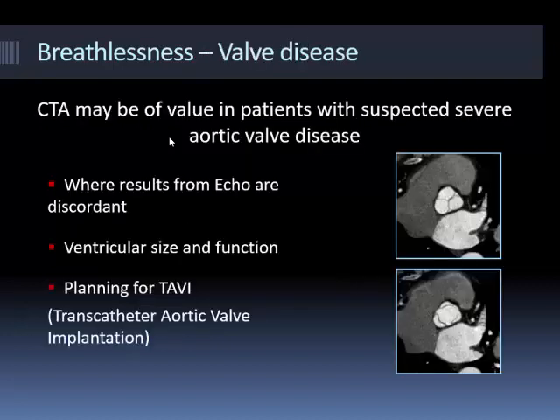Looking at valves, you'll hear that CT is now replacing echo and certainly TOE for TAVI assessment. People are getting more and more comfortable with annular measurements based on CT as opposed to any other 3D technique. Remember, if you've done a retrospective study, you are going to be able to do volumetric analysis, and because you're dealing with volumetric data, it means that your volumes tend to be very robust.